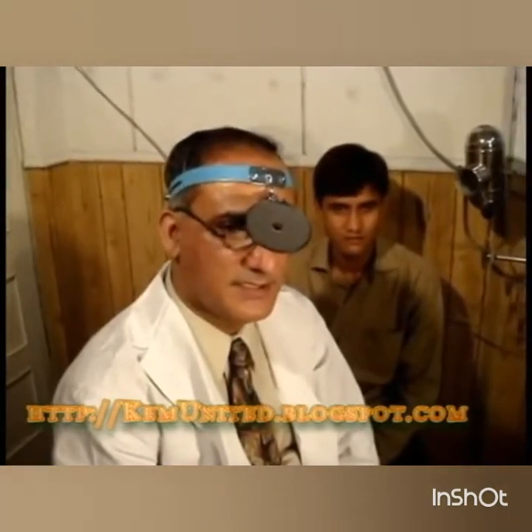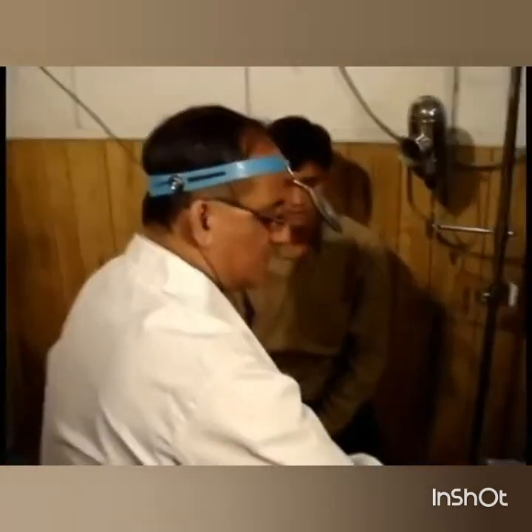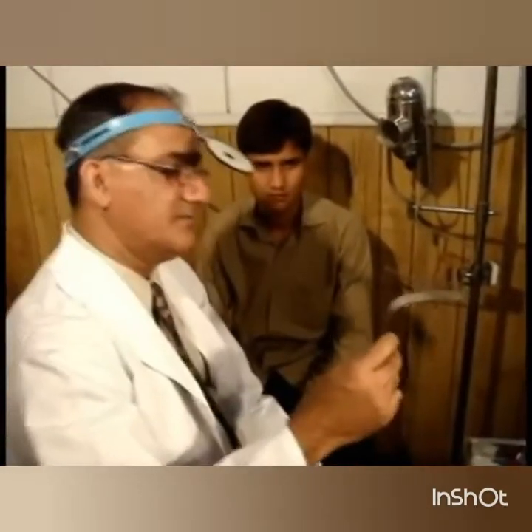Now we are going to examine the throat of the patient. In examination of the throat of the patient, we must examine the oral cavity, oropharynx, and then the larynx of the patient. So we'll start with the examination of the throat. For that we use this tongue depressor.